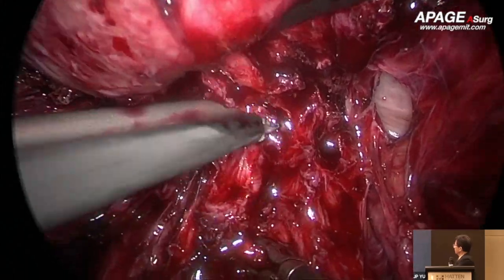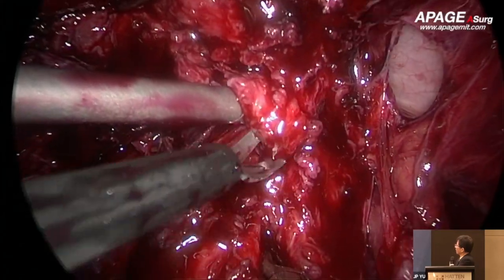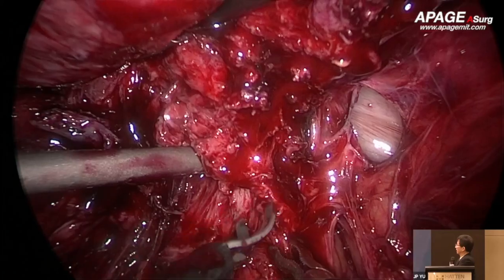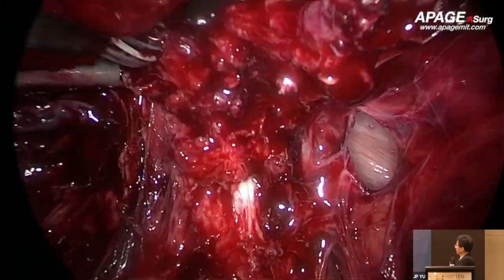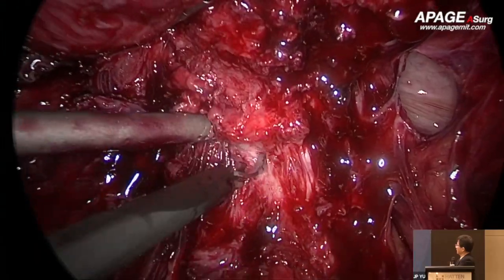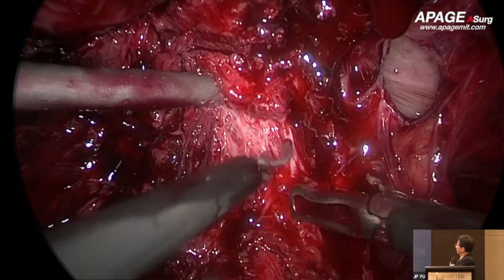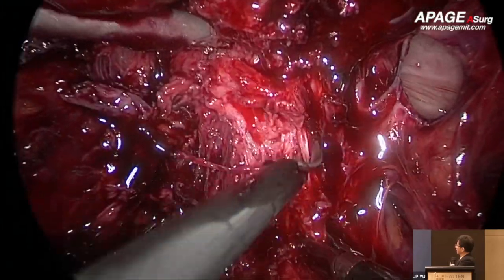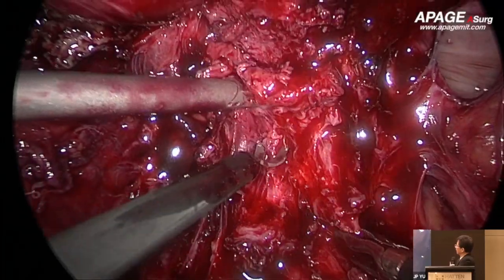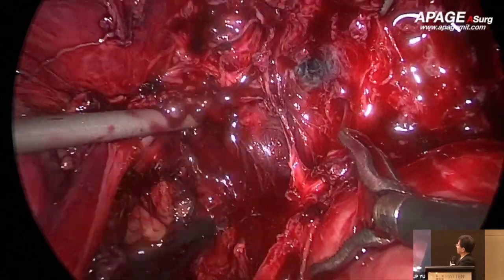Here you can find the regions still adhered to the posterior lip, and the prerectal space is difficult to identify. Inside here is the prerectal space, but there is a dense adhesion. You can see coffee-ground colored fluid coming out when you cut it. That is the colon and the endometrial lesion adhering to the cul-de-sac and the posterior cervix.